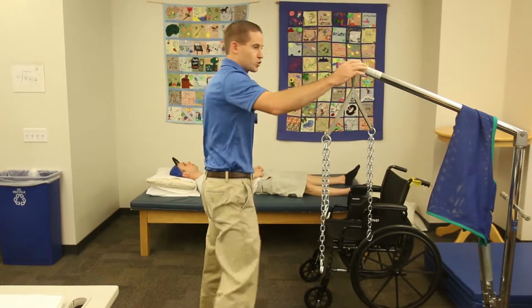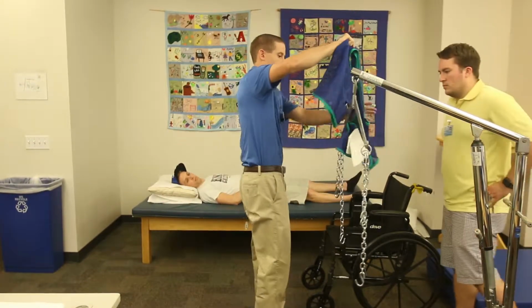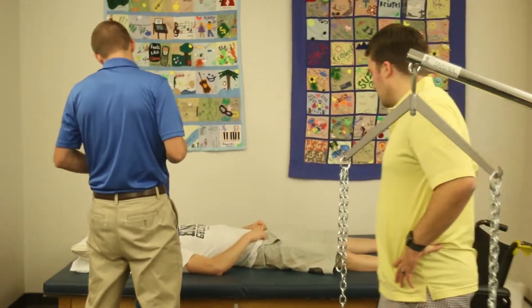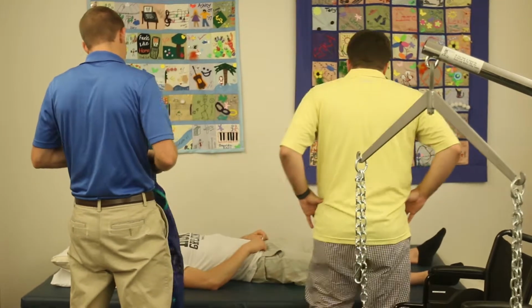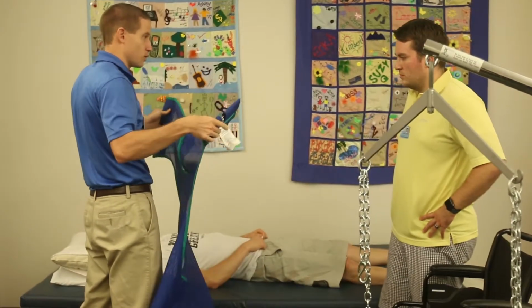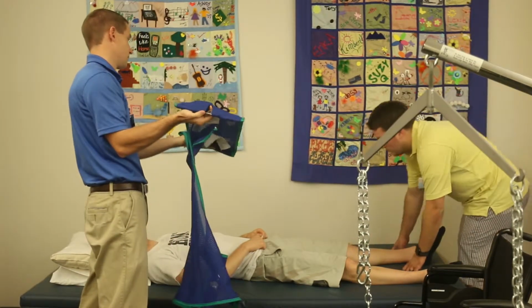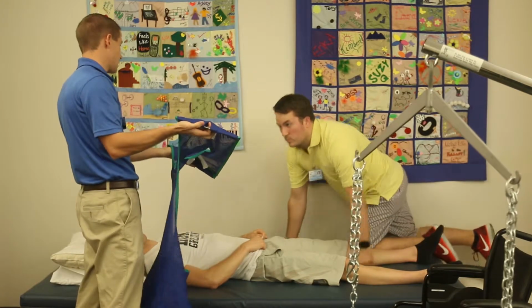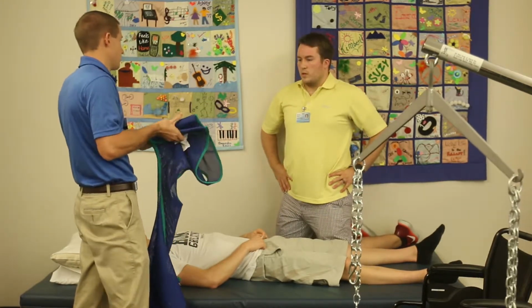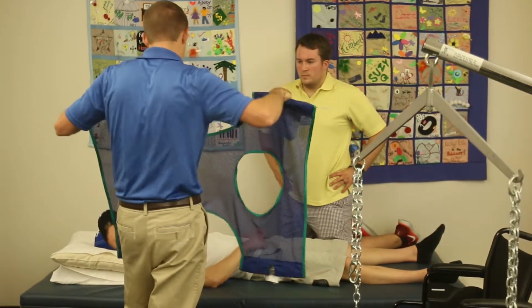All right, Jared. So what we're gonna do first is we need to get this sling underneath you in order to get you hooked up to the lift and get you up. So I'm gonna explain to my aide real quick what I want him to do. If you'll go around on that side with him, this part needs to go right beneath the buttocks area. And we need to make sure that the tags are on the bottom, just so that way it's most comfortable for him. And then as we go, we'll keep explaining it.